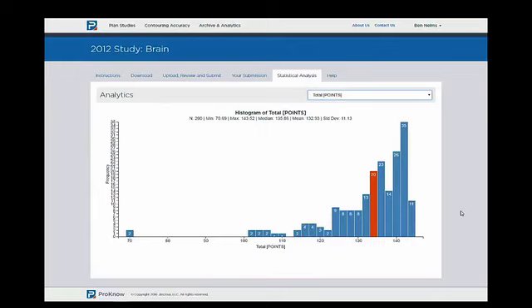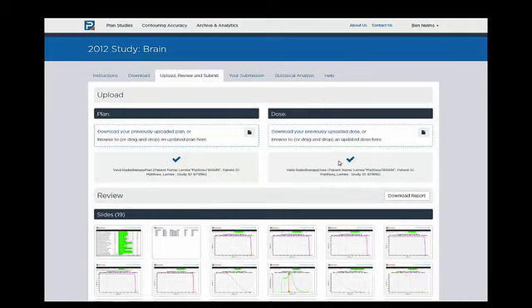And even if it's a year later, and let's say you have new skills, new training, or a new planning system, you can always go back and upload a new plan and dose and get scored and see what your new score is. You can't submit it to the study because the study is over, but you can constantly assess your performance versus that original population. So we have a pretty exciting set of tools here for you to be able to interact and take part in a plan study.